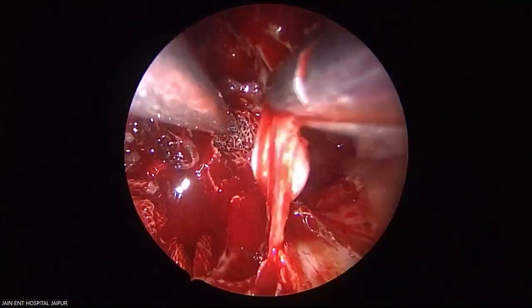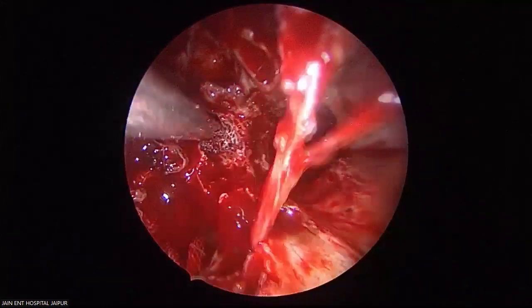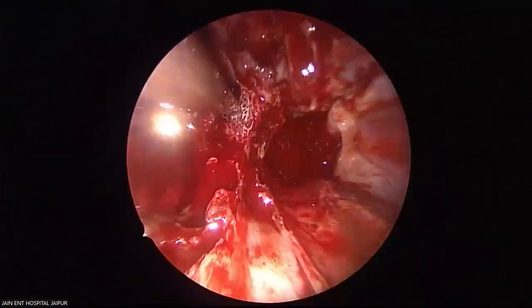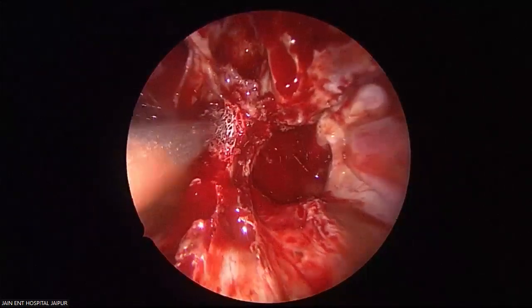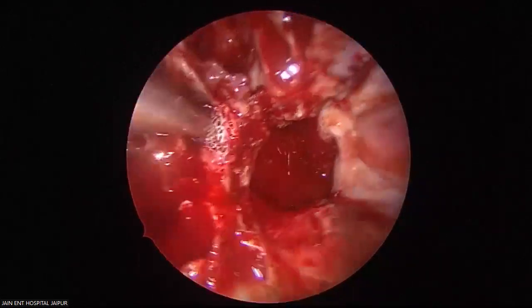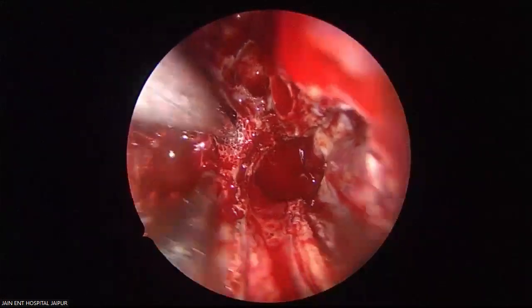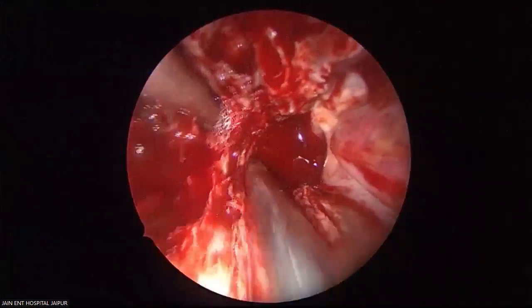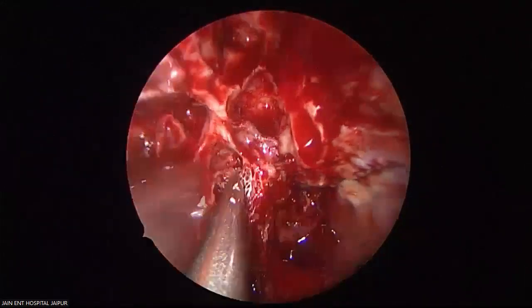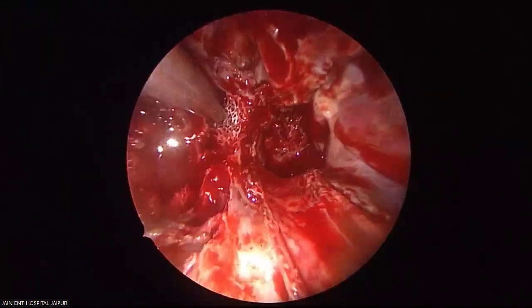This is all the remnant tumor part. See the tumor bag within the pterygoid fossa. To me, the tumor has been completely removed. Now, this honeycomb bone, I told you, when you remove the tumor from the pterygoid fossa, it has to be a controlled one. Secondly, don't press with gauze or anything. If you press with anything, you can press the tumor inside. So always allow the bleeding to come out.